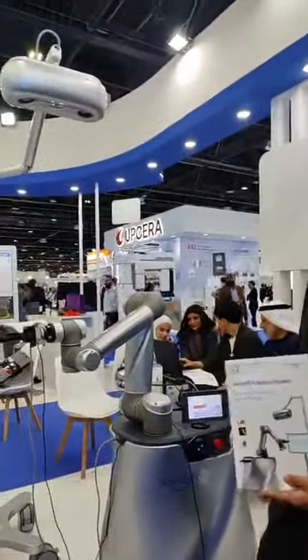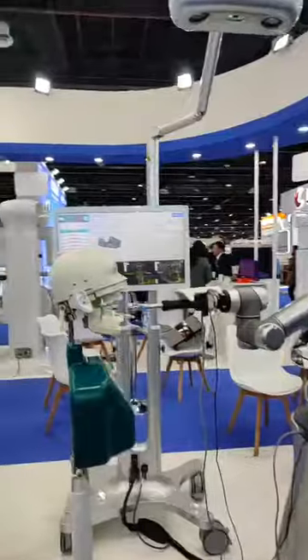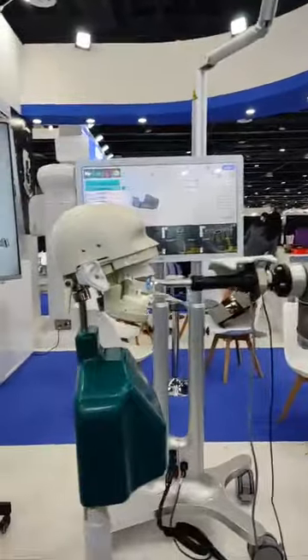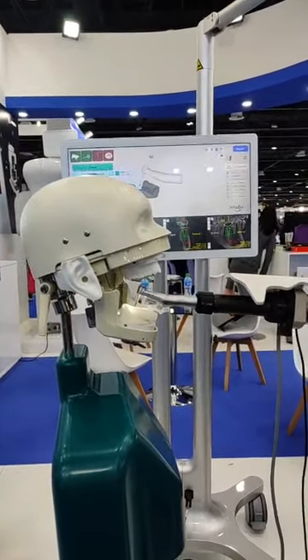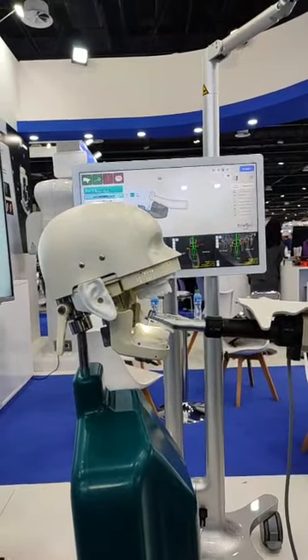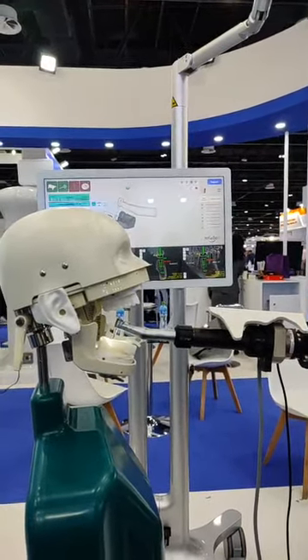You can see in the surgery, the surgeon only needs to use a foot pedal to control it. You select the drill you want to apply, then the robot will go inside the mouth, then do the drilling automatically. When it reaches the desired depth, it will go outside.